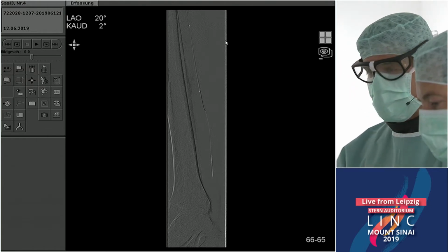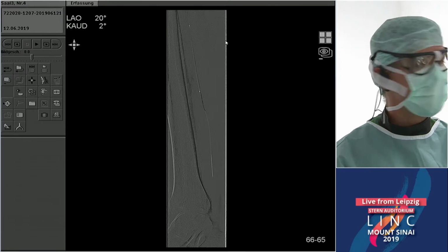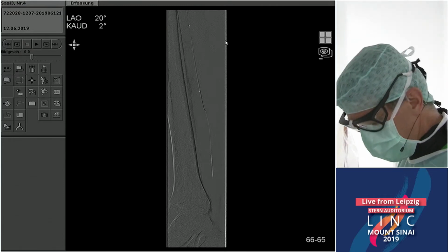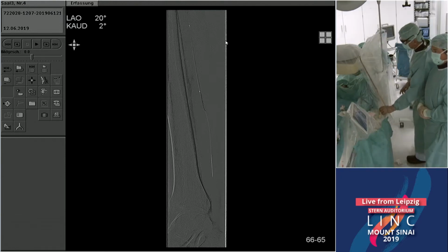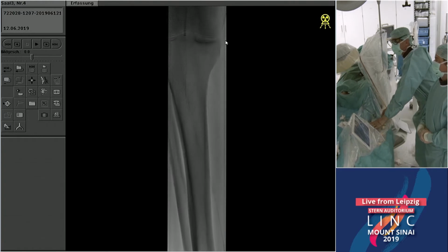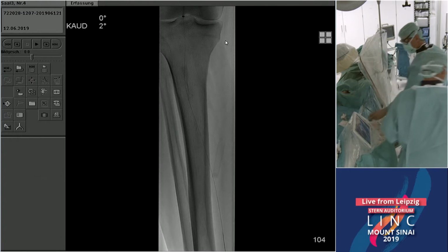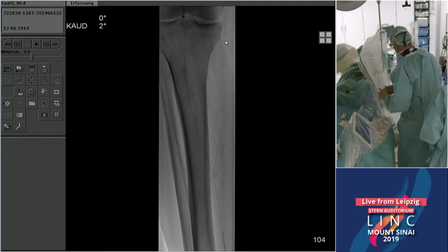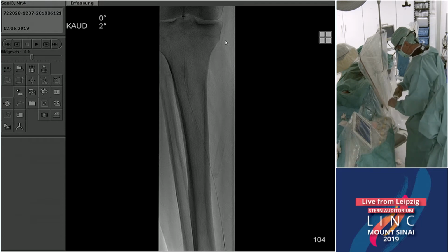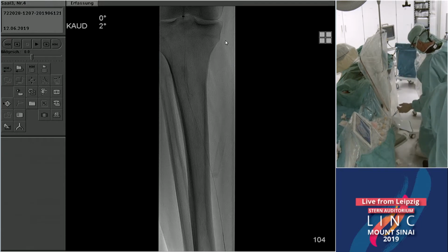So Andre, what does the result look like above in the TP trunk, which was the area that looked most diseased, and there was bad dissection before? Could you talk a little bit about how you decide when a flow-limiting dissection is significant enough in the infrapopliteal circulation that you would consider placing a scaffold? Or in your experience, have you found that for certain dissections the DCB actually heals very, very well here, and that a scaffold is not necessary?